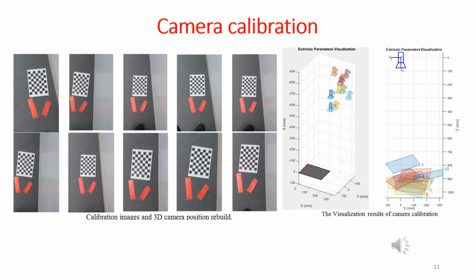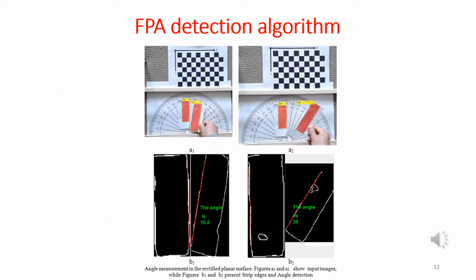After wearing the harness, 10 pictures were taken from different angles on top of the calibration checkerboard to calibrate the camera lens and remove the lens distortion. The rectified image allows metric properties such as planar angles to be measured from those perspective images. In the validation test, the angle between the two strips was detected accurately with an average error of plus or minus 0.05 degrees, through the chest-mounted camera simultaneously.